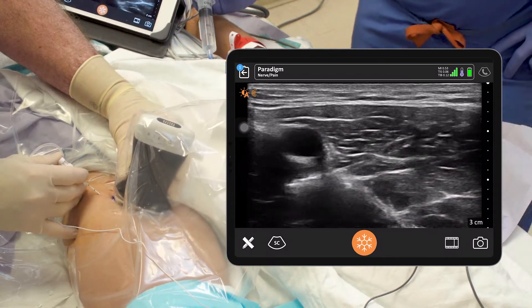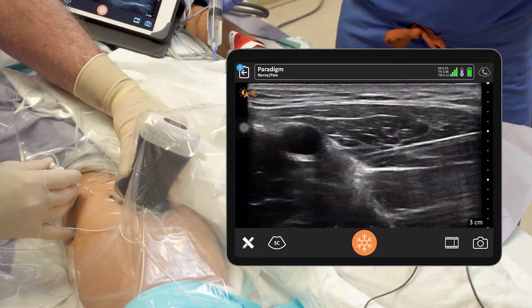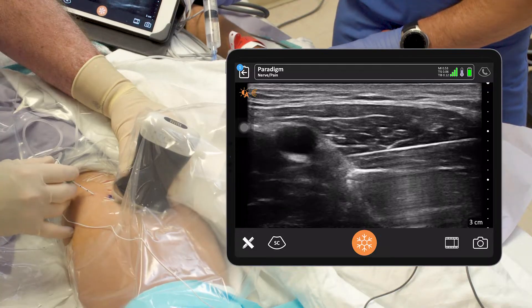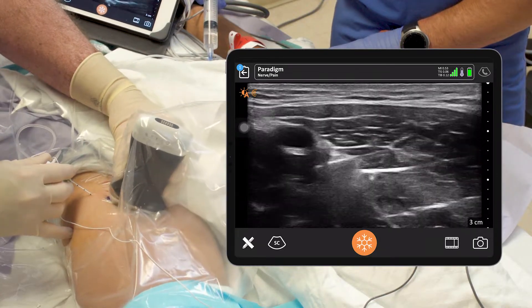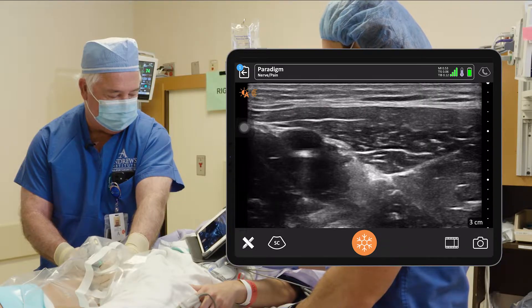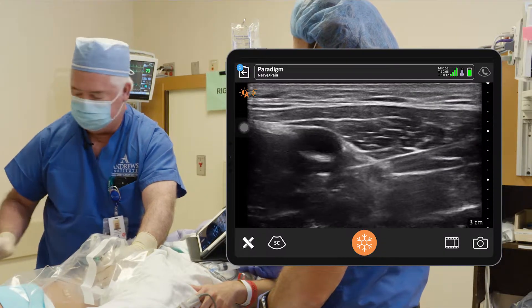Okay, Rocky, give us five right there — one, two, three, four, five. Five more — one, two, three, four, five. I'm going to scan down the leg just a little bit so we can see the spread down the leg. We should see the local coming down a little more distal to the needle, and then I'll come back to the needle and we'll put our catheter in right there.